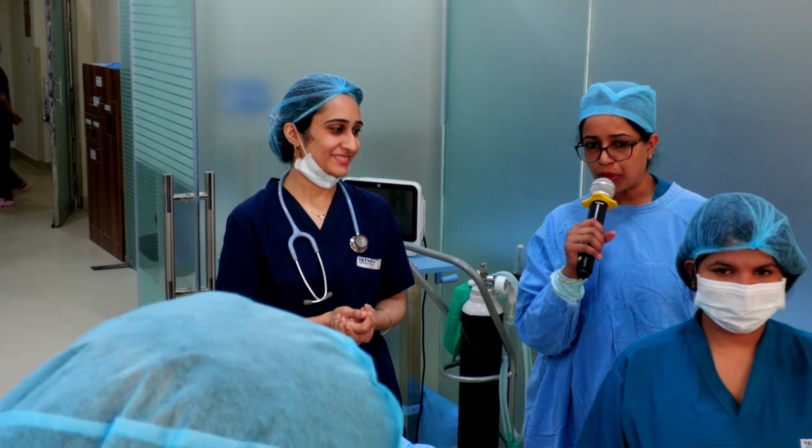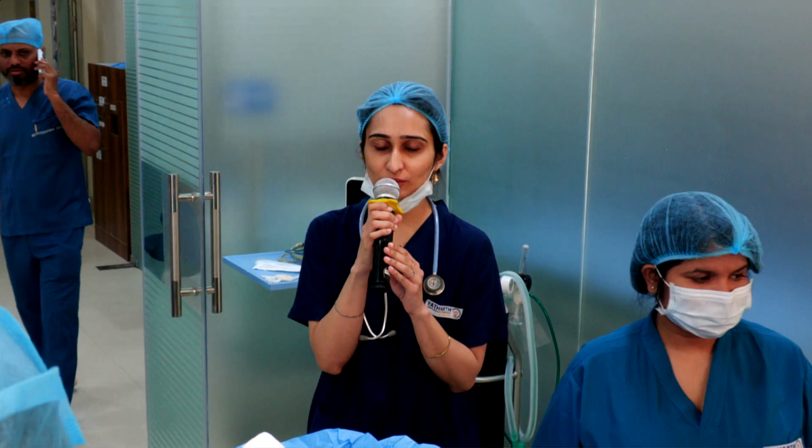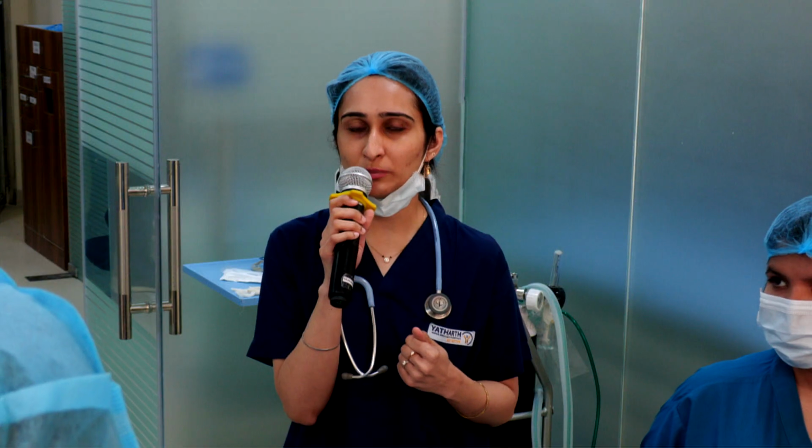They'll just brief you about what the patient is posted for. So we are ready with the next block, everyone. This is a 36-year-old female with cholelithiasis, and she is posted for laparoscopic cholecystectomy. Dr. Hetal sir will give a rectus sheath block and EOI, external oblique intercostal block, in this.